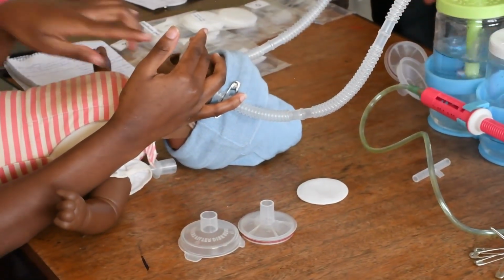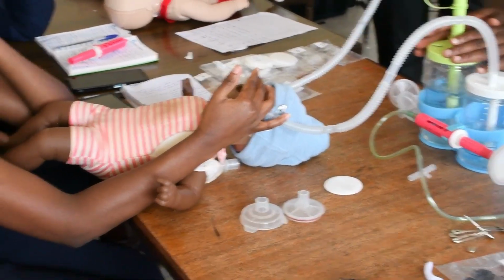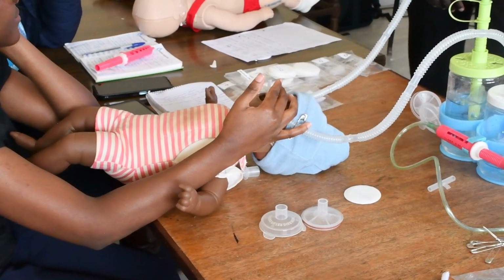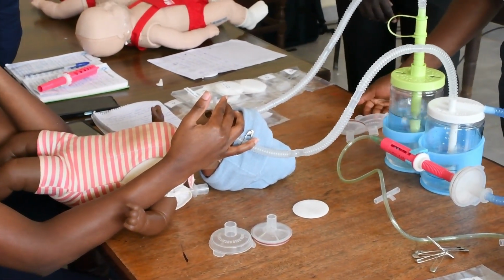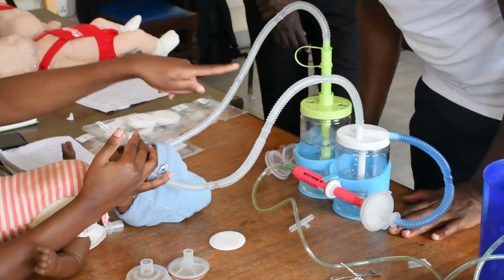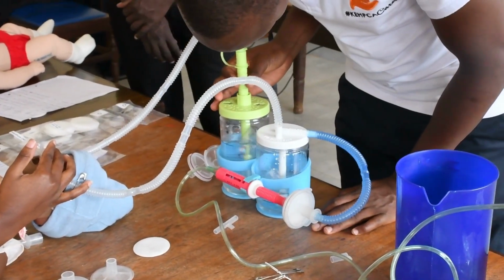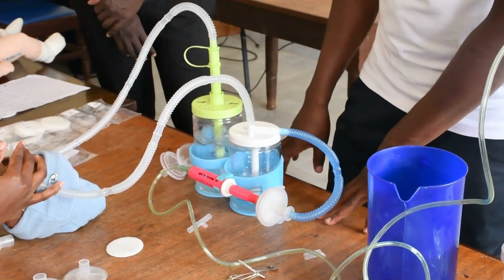Next we are testing two parameters: the applied pressure and then the percentage of oxygen. Based on the oxygen level here, it's continuous.